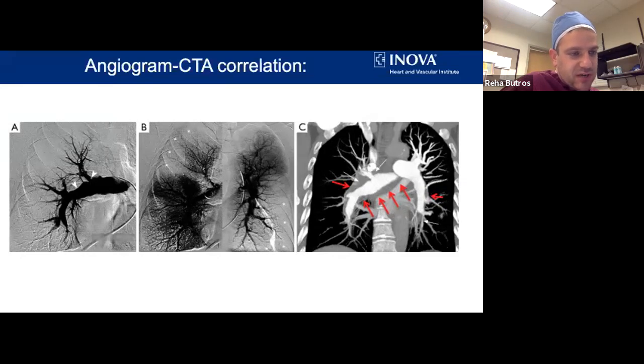Sometimes in patients where the pre-treatment suspicion is very low, we do a more non-selective angiogram, so you can really limit the contrast with a non-selective one. But if you go to each individual segment and try to get good pictures of every single segment, then you're increasing the contrast to probably 120. The most we've done was 140, I believe. But in Japan and France, they give up to 400 cc's. We've never done that.